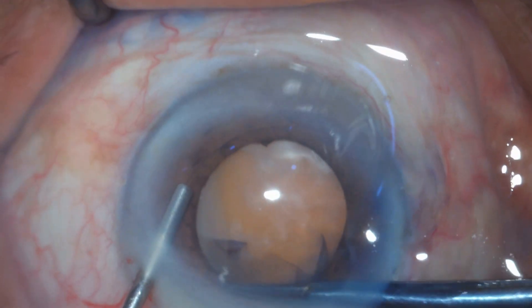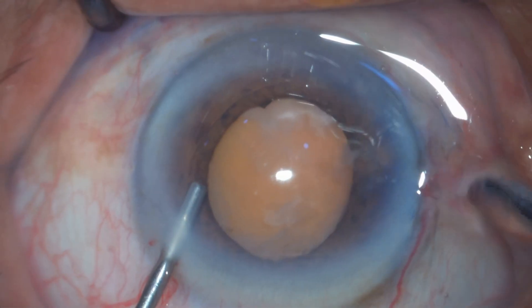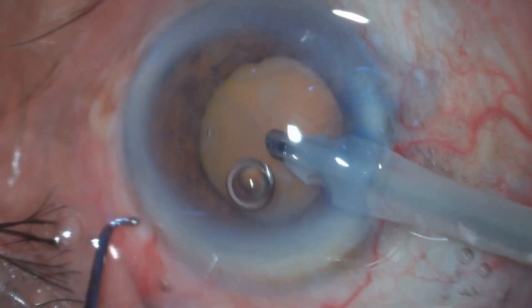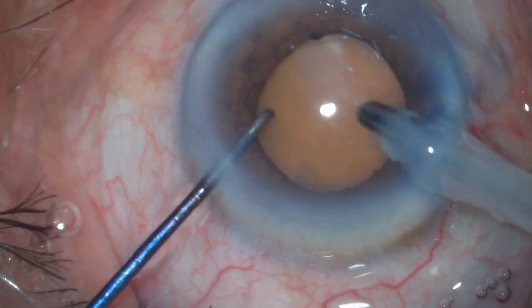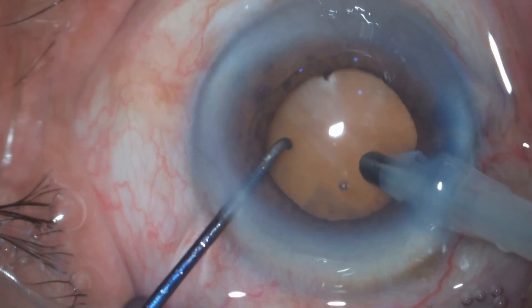In many places the capsule is fibrosed and zonules are quite weak in these kinds of patients, so we have to be very careful while doing capsulorhexis. My target capsulorhexis is around 5 to 5.5mm. There is hardly any cortical matter — it's nucleus only into the bag — so there is no need for hydrodissection.